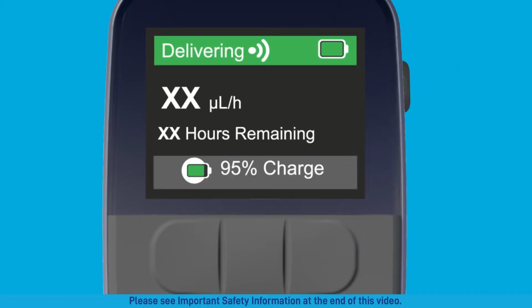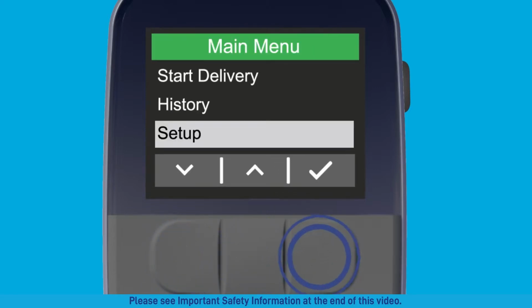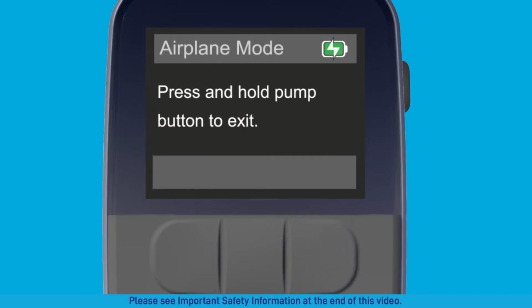To put your remote into airplane mode, press the side button to wake up your remote. Then, go to your pump's main menu by pressing each front button left to right to unlock your screen. Scroll down and select Setup from the menu. Select Airplane Mode and press the check mark to confirm. Your remote is now in airplane mode.